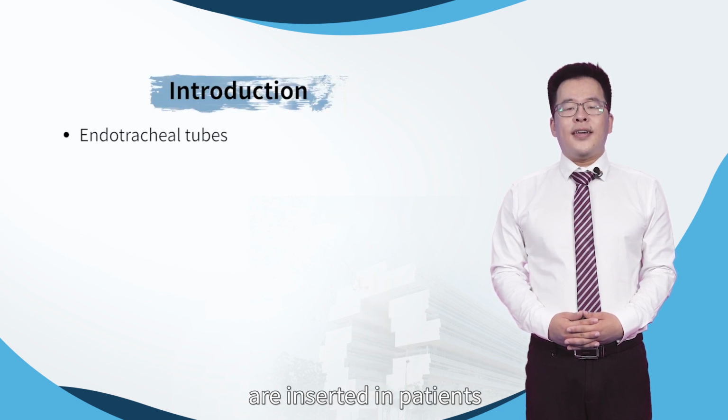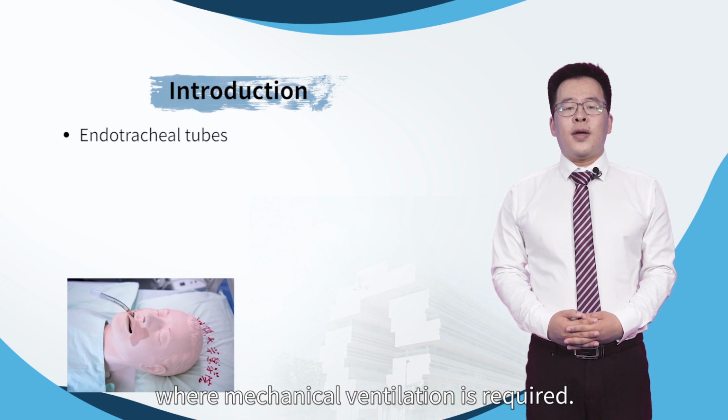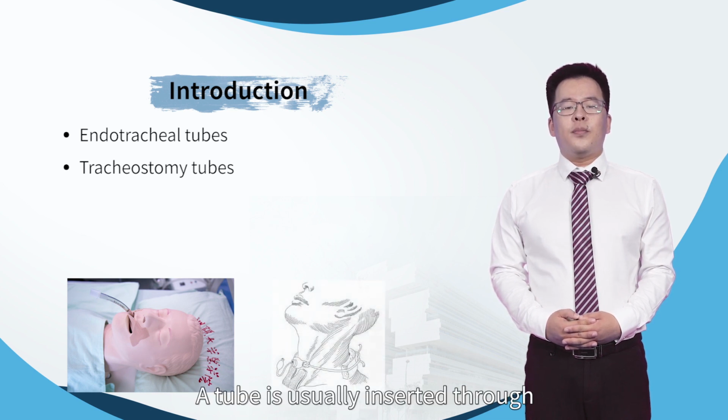Endotracheal tubes are inserted in patients whose breathing may be compromised when undergoing surgery or for those when mechanical ventilation is required. A tracheostomy is an opening into the trachea within the neck. A tube is usually inserted through this opening.